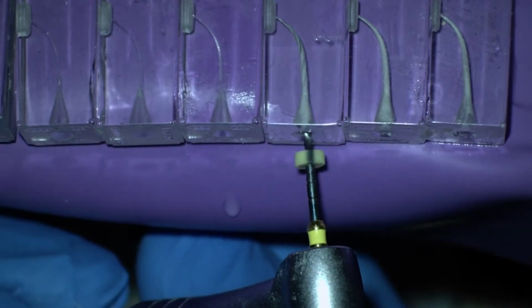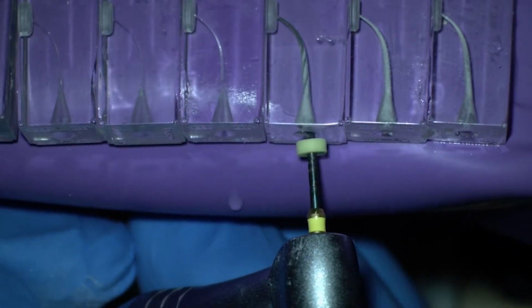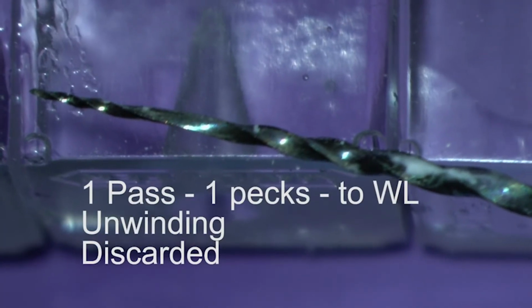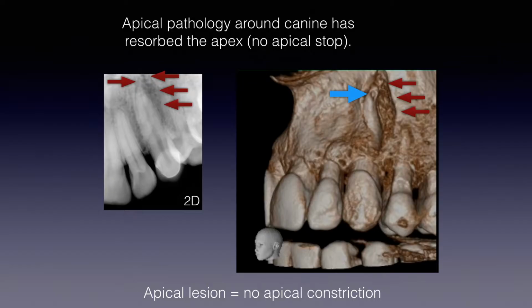It spun tons of times, hundreds of times potentially inside that canal before you took it out and realized, oh, it's unwound. An unwound file that's maybe 21 millimeters to begin with now is 22 millimeters. So all of a sudden, you instrumented, let's say, a millimeter longer than what you thought. You blew open that constriction, didn't think much of it, and then wonder why now when it comes to obturation, you're getting stuff out the apex. It's because, again, you didn't quite appreciate what's happening at the apical constriction.